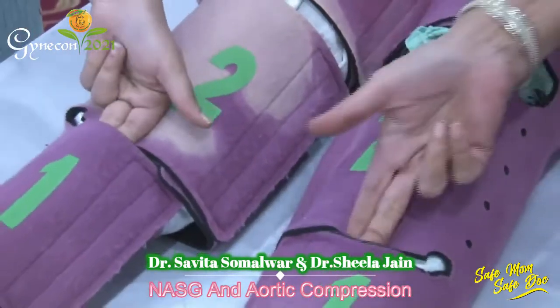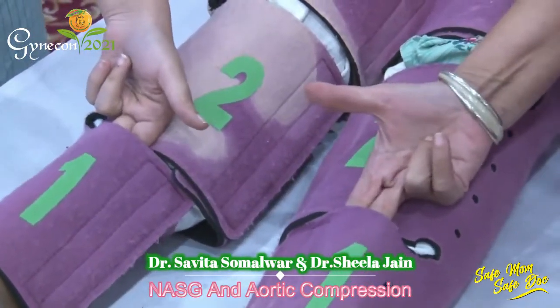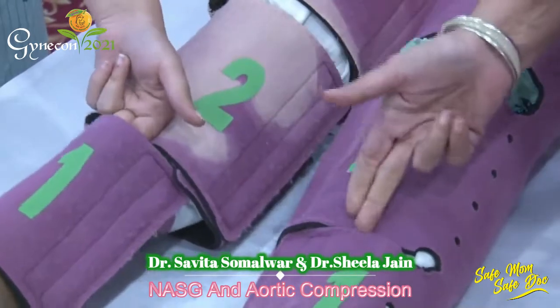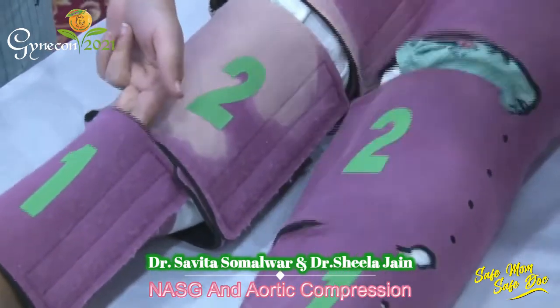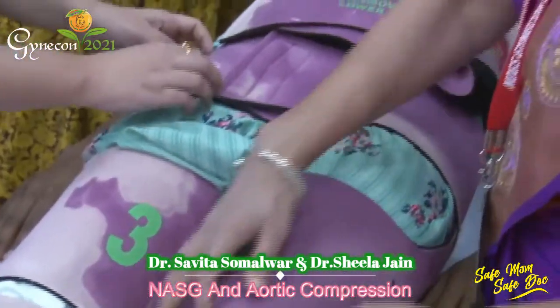Once you have closed all the segments, introduce two fingers and pull them out to perform a snap test. This shows that the garment is applied properly — neither too tight nor too loose.